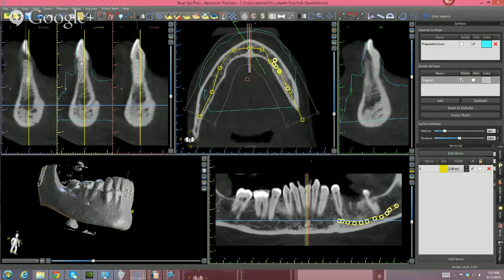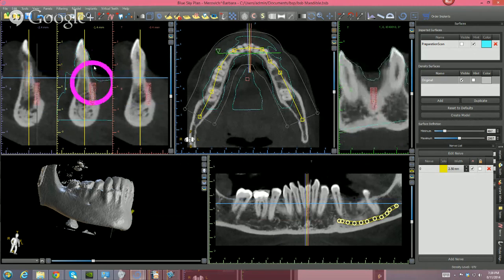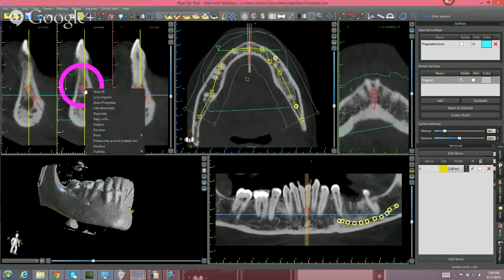And you put one in here, fine. Everybody's happy, but not really, and it's nowhere near it, and you're good. If you wanted to put one here for some reason, I don't know why you would do that, but let's say you were doing that, that would not be a good idea. Okay?